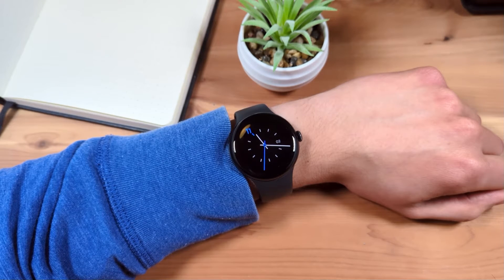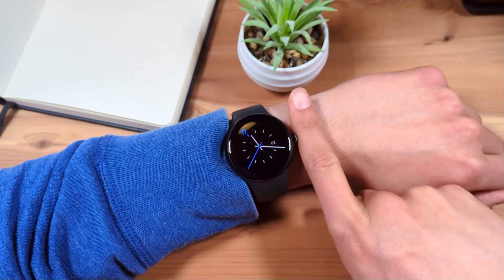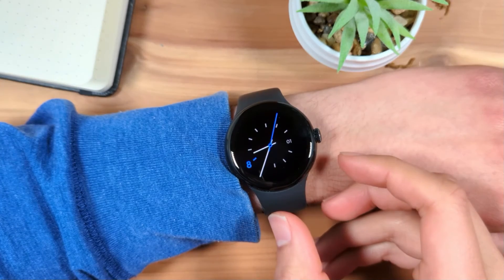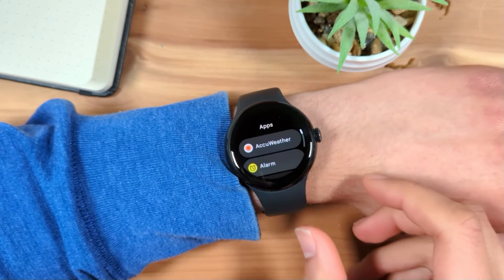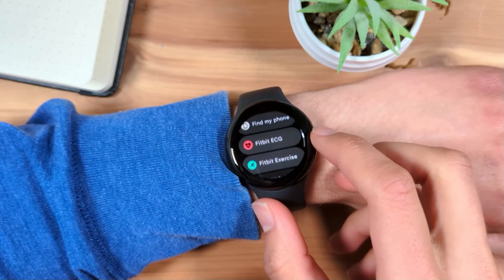First, make sure your watch is properly positioned. Google says you should place your Pixel Watch one finger width from your wrist. From the watch face, press the crown to open apps. Scroll down and select the Fitbit ECG app.